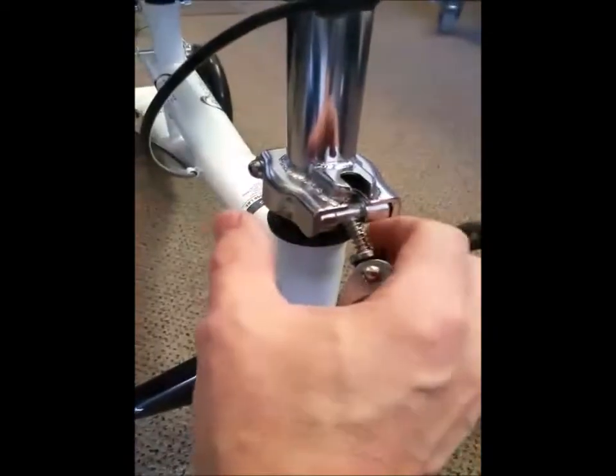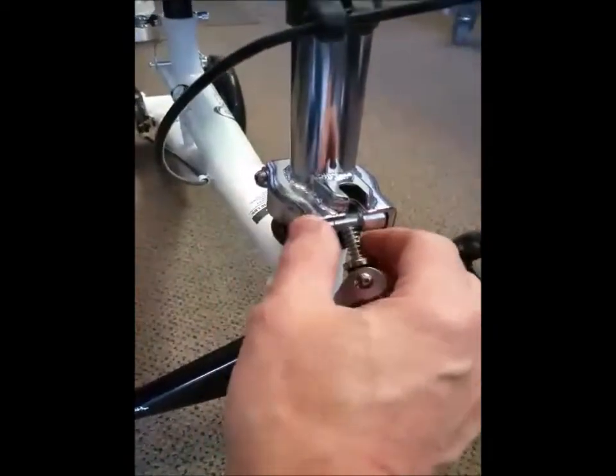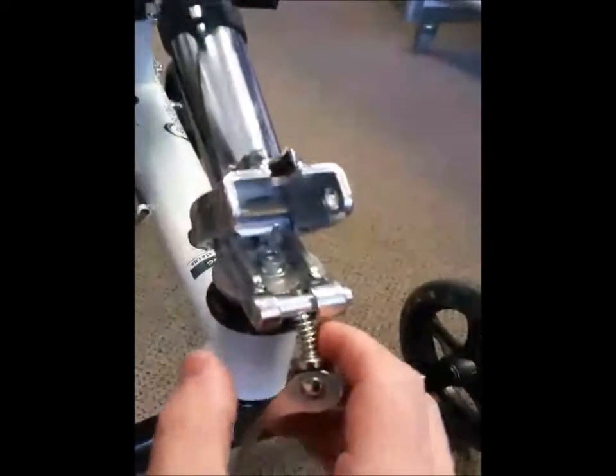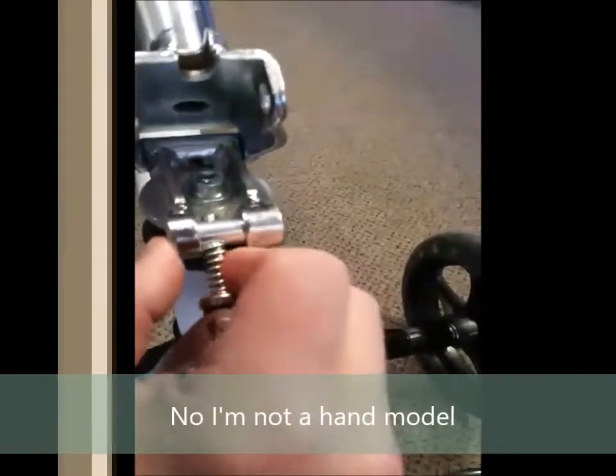You want to keep that nice and tight. Put your hand in with your index finger here and your thumb here, and when you push it, it'll drop down — just give it a shove. That's all it does; it's just a little lever.